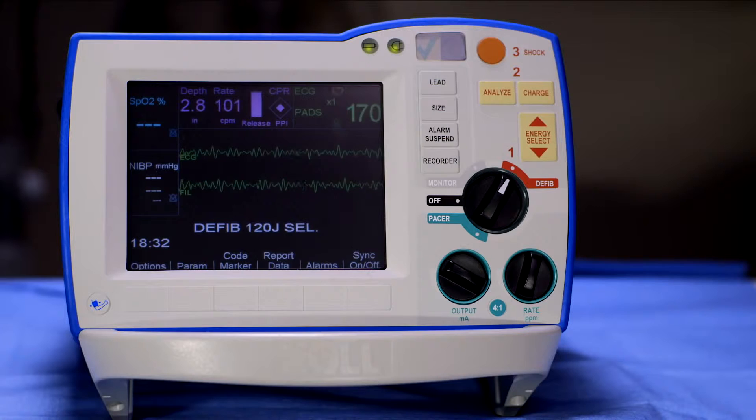If your compression depth or rate falls outside of guidelines, the numerical value of rate and/or depth will turn red on the CPR dashboard. The R-Series defibrillator will also provide an audible message, and a metronome will beep to help you reach 100 compressions per minute. This real-time feedback can help ensure you are doing high-quality chest compressions.